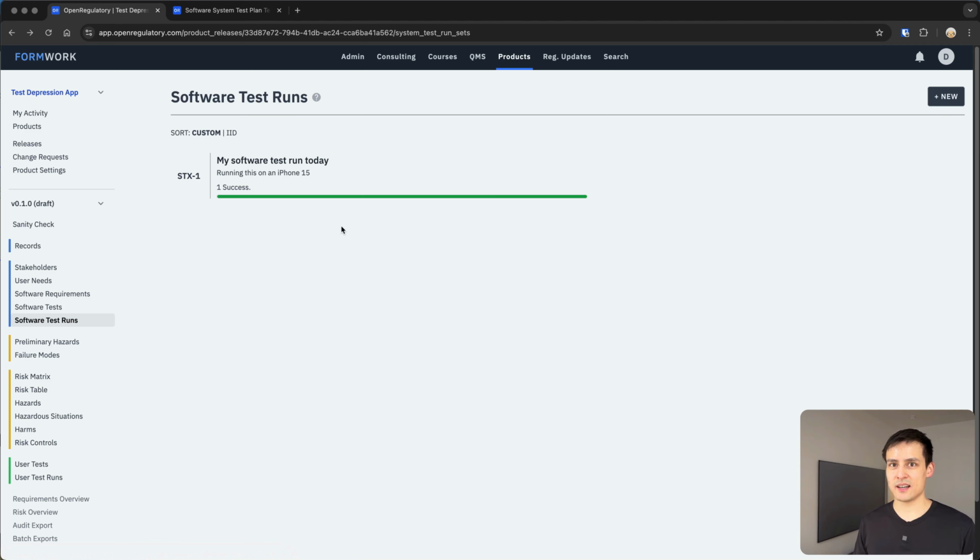Typically how you would create an automation would be, you have some sort of test suite, it runs on GitHub Actions, and you get some sort of output. Unfortunately, the output usually is just all tests pass or some tests didn't pass. If some tests didn't pass, you maybe get the ID of the section in the code where those tests were defined, and that's kind of it. That's cool for day-to-day development because you see, hey, is my test suite passing? However, for regulatory compliance, we need more information than that our test suite is passing.